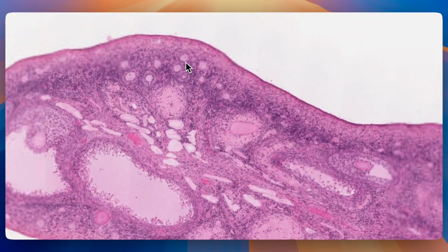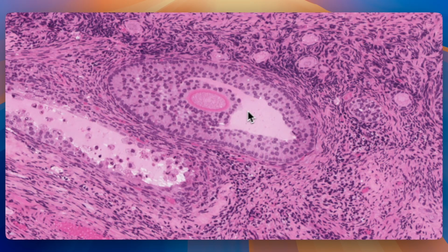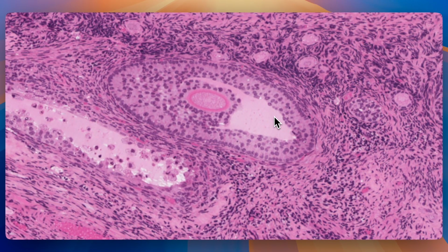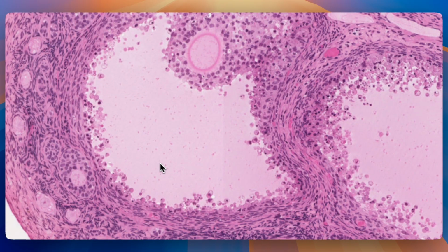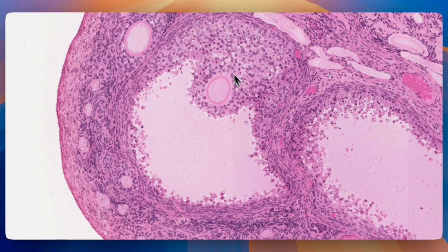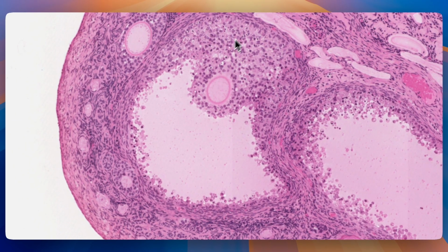Now, what distinguishes primary from secondary follicles is the presence of this fluid-filled antrum, okay, this space here, which contains hormones. So if you see a small antral space, it's a secondary follicle, okay, zona pellucida, oocyte in the middle. And if that antral space is massive, and it's inching closer and closer towards the cortex, that is a tertiary or a Graafian follicle. Okay, here we see that there are special granulosa cells that anchor the oocyte to the lateral wall of the follicle.